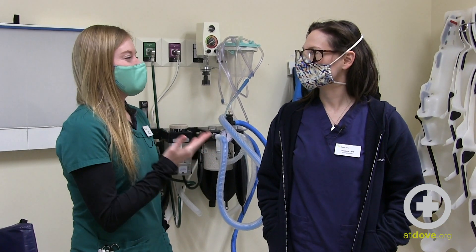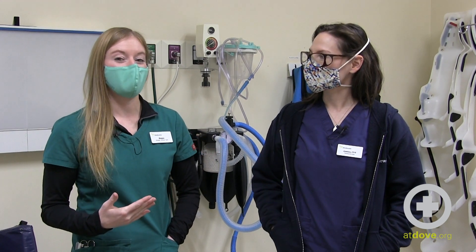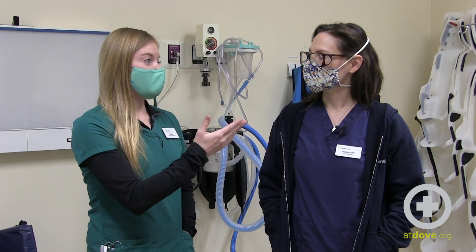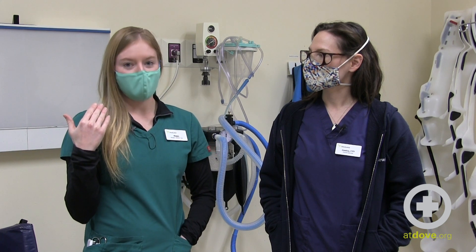My coworker Jess is modeling lead-lined glasses that can also be used to supplement the PPE you're wearing when taking radiographs. These glasses are lead-lined and they're going to help protect your eyes when taking those radiographs.